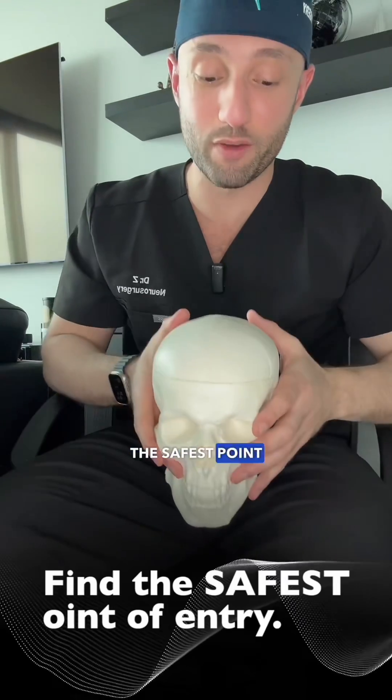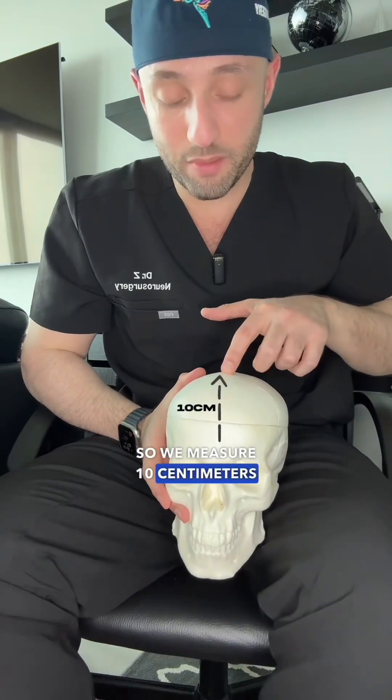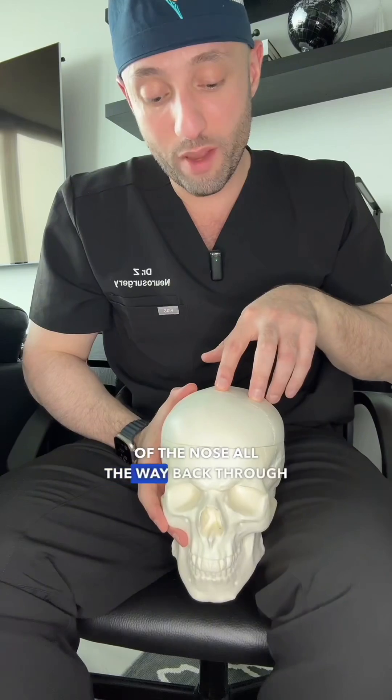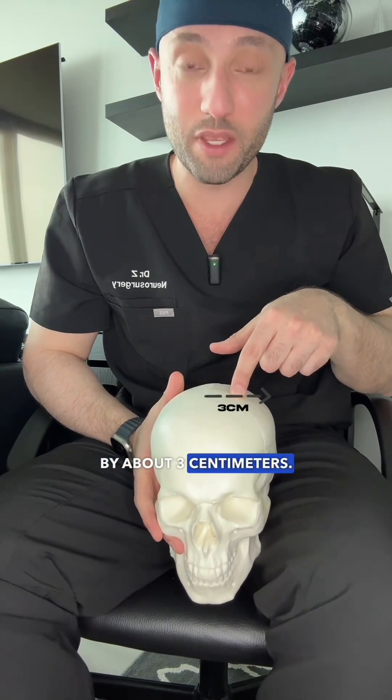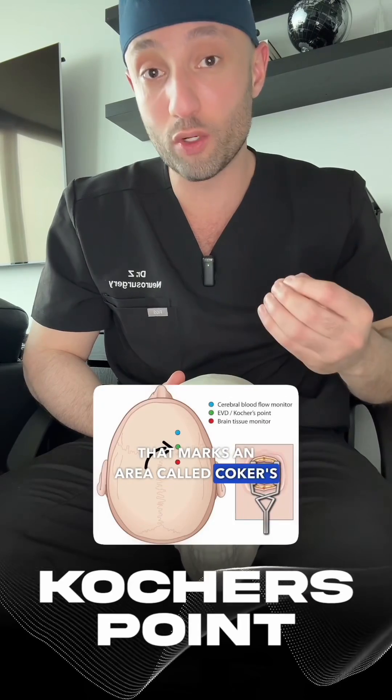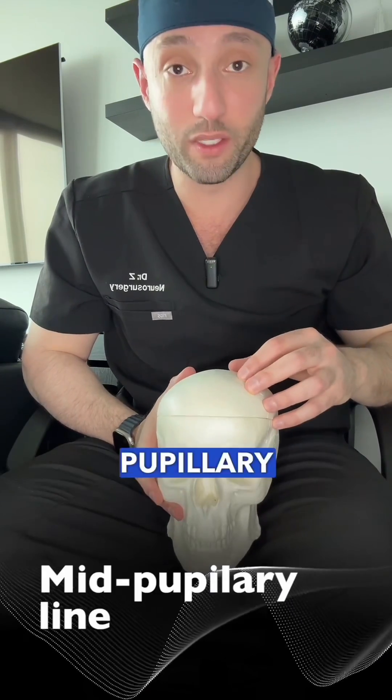First you need to find the safest point of entry. We measure 10 centimeters back from the top of the bridge of the nose, all the way back through midline, and then we go out to the right by about three centimeters. That marks an area called Kocher's point, usually referred to as the mid-pupillary line.